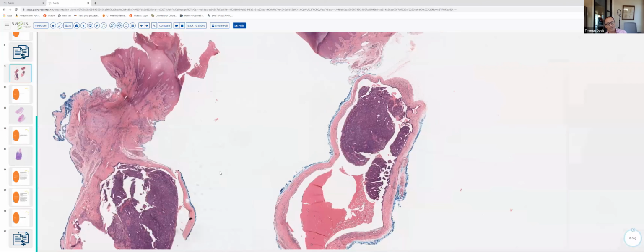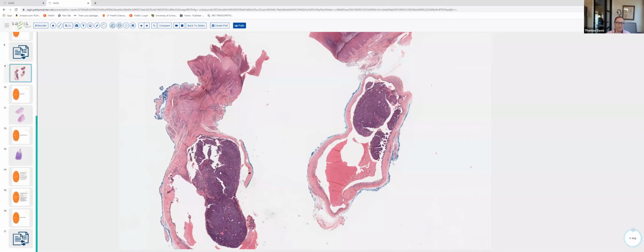One of the clues to the diagnosis, of course, is the anatomic location of this lesion. Digital papillary adenocarcinomas are most common on the fingers, and you're not going to see a Hidradenoma papilliferum in a volar location such as this. And generally, the teaching point with these digital papillary tumors is when you see a digital papillary tumor, you really want to assume that it is malignant. They really should all be considered carcinomas, because the metastatic potential for these aggressive digital papillary adenocarcinomas is quite high.